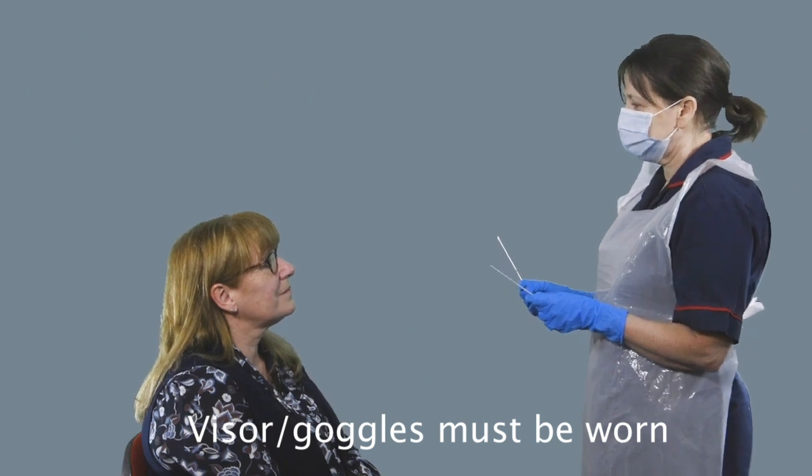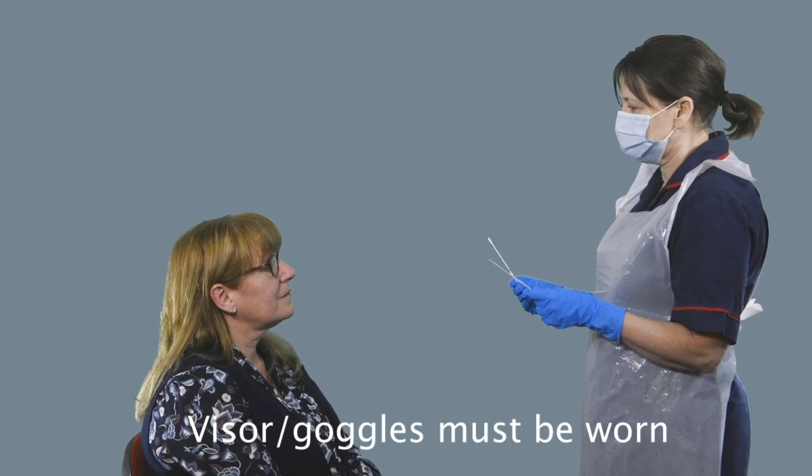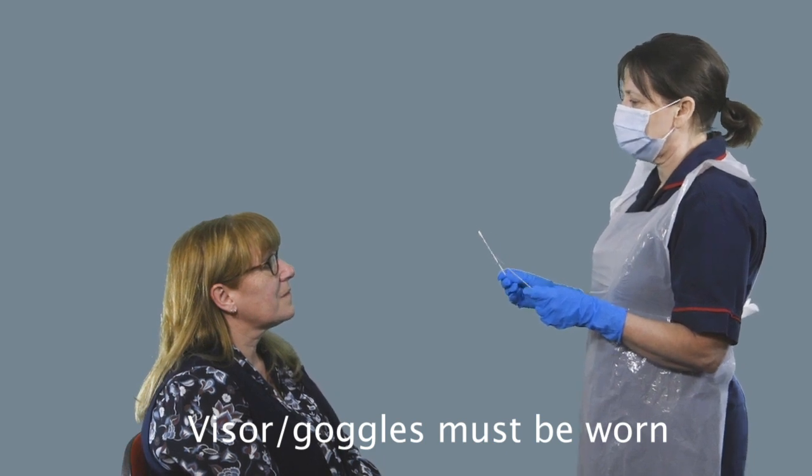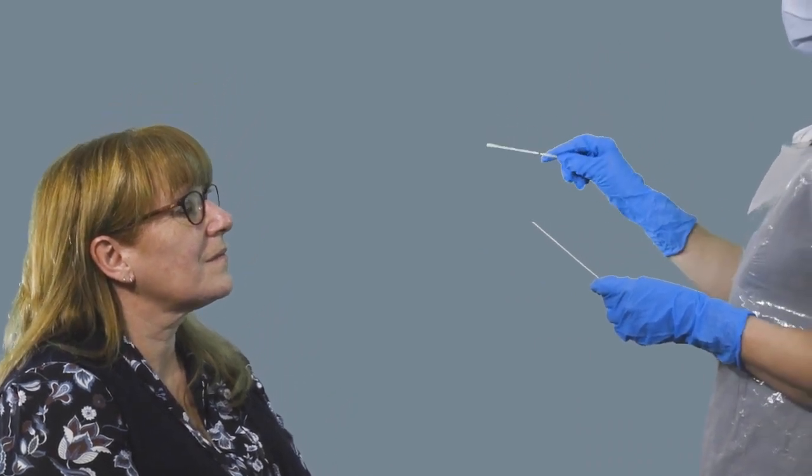So you're now going to prepare your patient. Introduce yourself and tell the patient exactly what you're going to do. Ask them to open their mouth wide, tip their head back slightly, and you're then going to get the swab and rub it at the back of their throat and then up either nostril. They may experience a gagging sensation and they may retch. Assure your patient that that is normal and that you'll work at their pace.